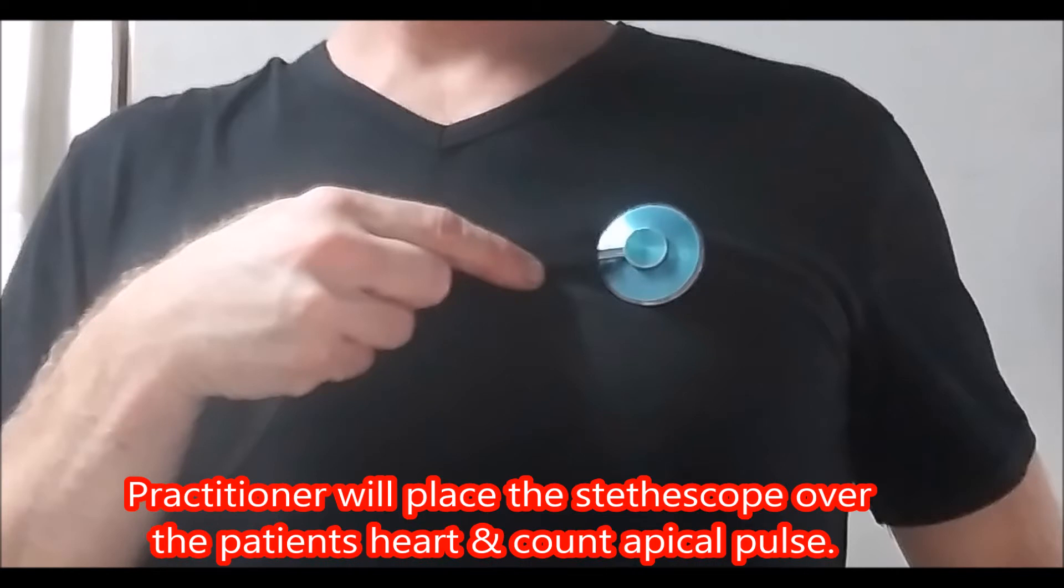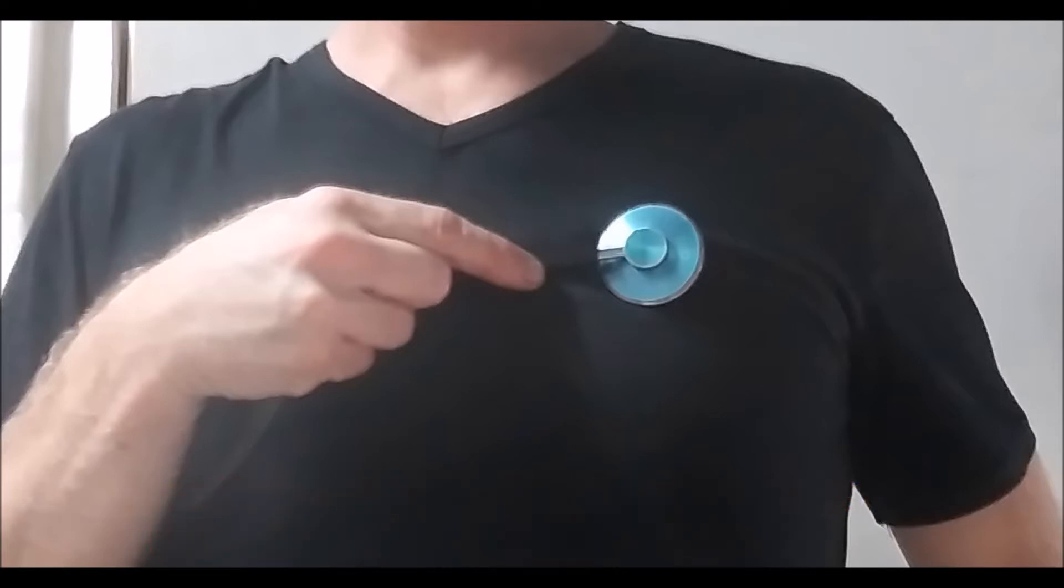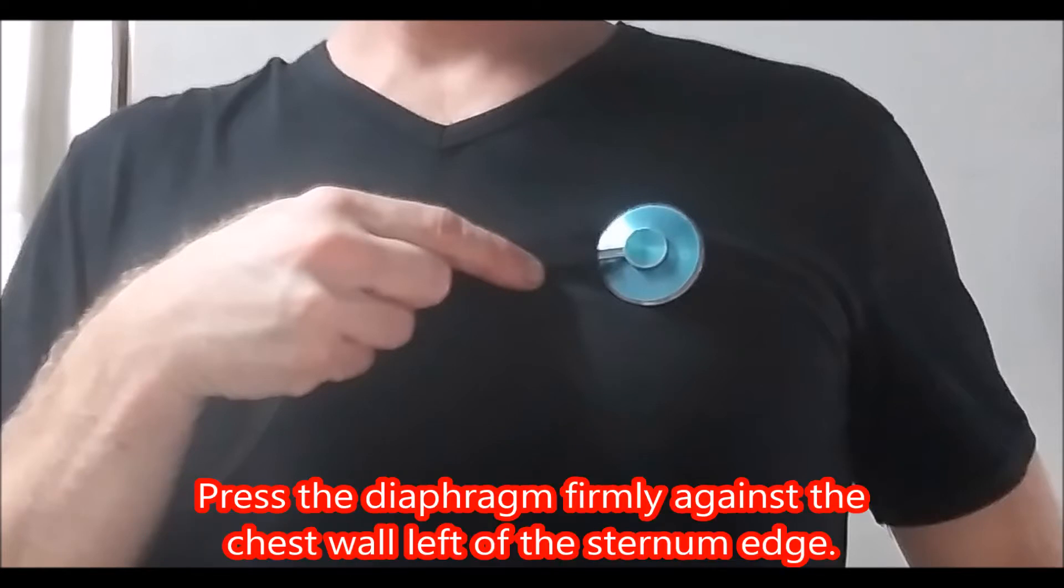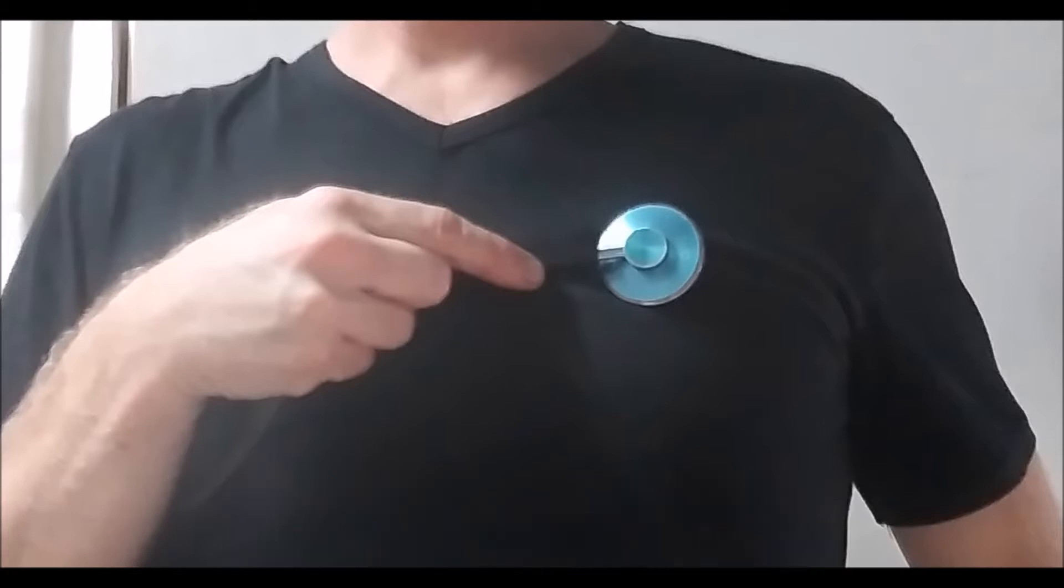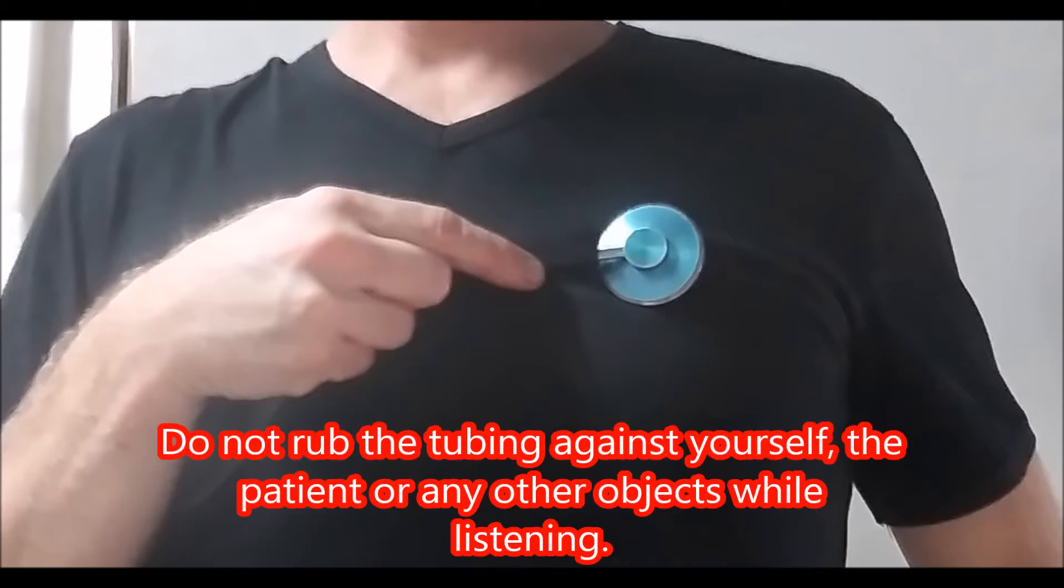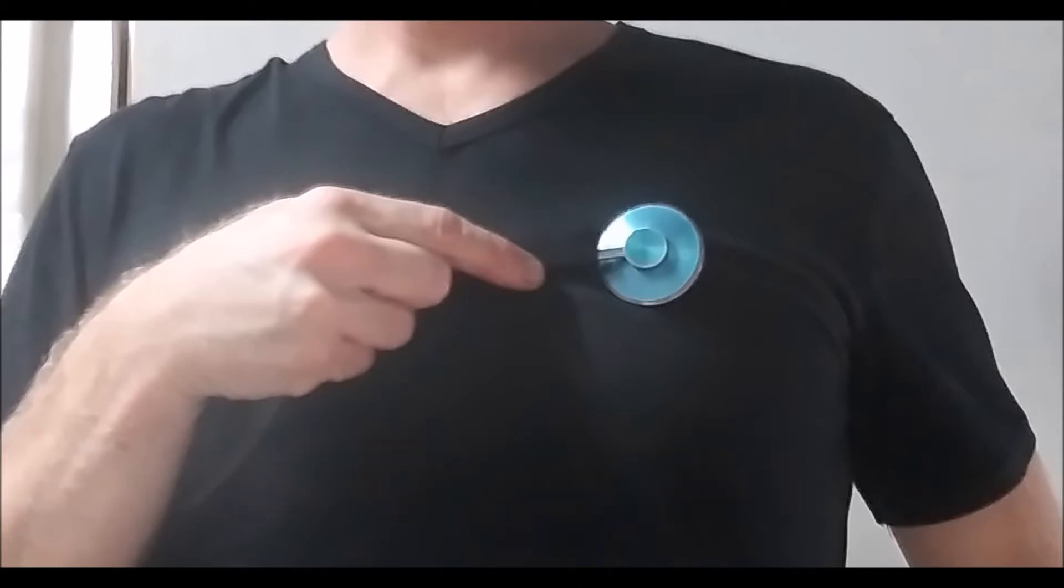The practitioner will place the stethoscope over the patient's heart and count the apical pulse. Press the diaphragm firmly against the chest wall left of the sternum edge. Do not rub the tubing against yourself, the patient, or any other objects while listening.